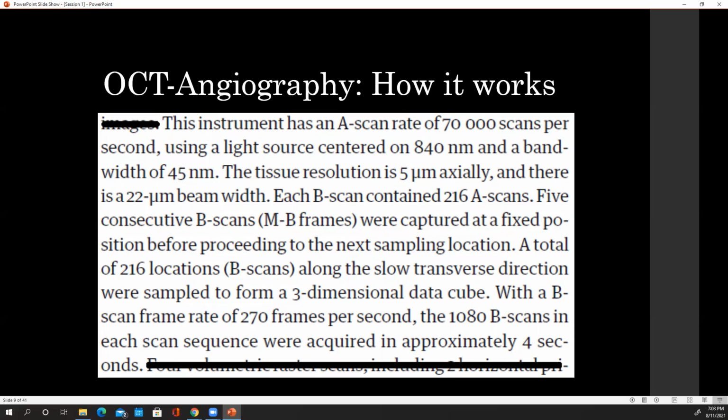Yes. Okay. This paragraph I want to go through because it's kind of confusing. It's the flyover paragraph, as I always say, right? It's in the materials and methods. You're kind of like, unless you understood it. When I first read it, it's like, oh God, okay, I'm just going to pass through it and let's figure out what the clinical correlation is. But I think it's instructive to go through this.